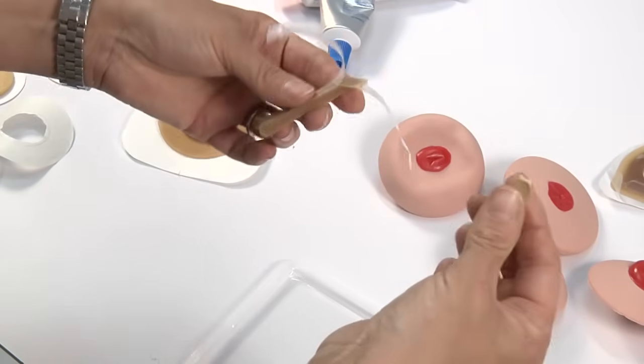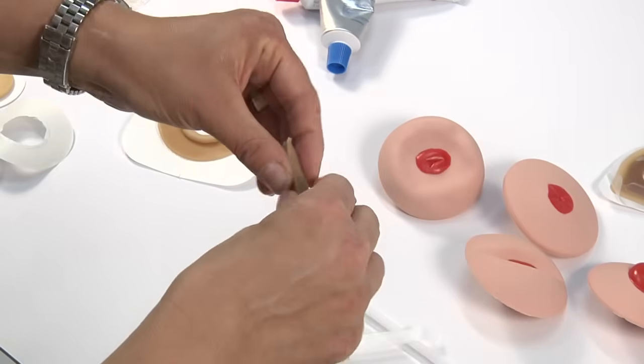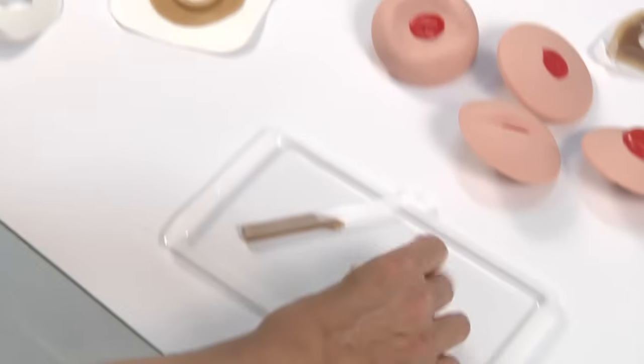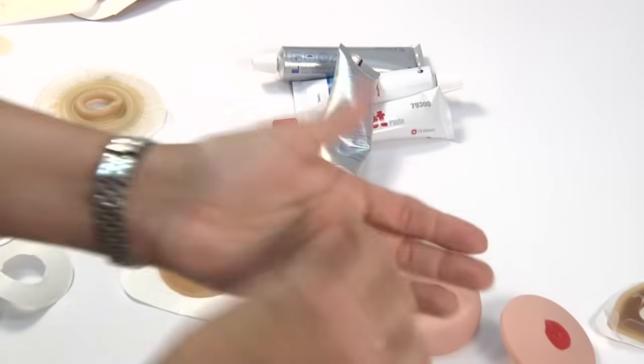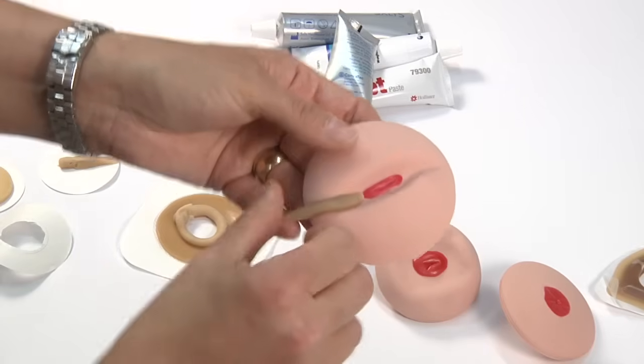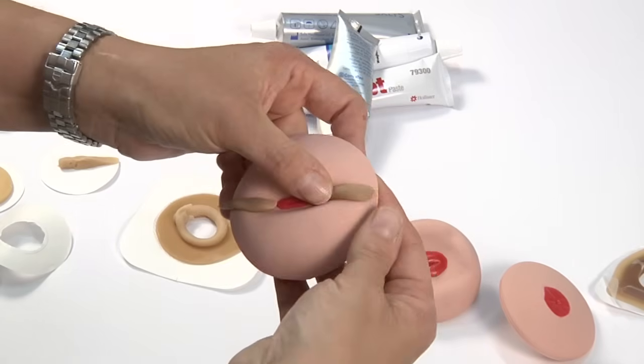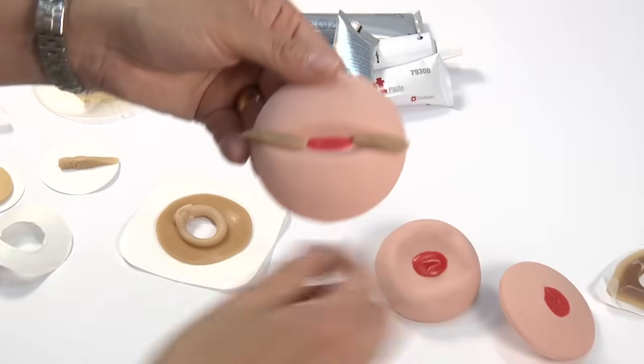So if you want to dose it, you would just pull off a portion of it like this. And as I said, you could do a couple of things. You could roll it in between your hands like this. You could take off a portion and fill in your crease on either side, and then continue on with your regular pouching.